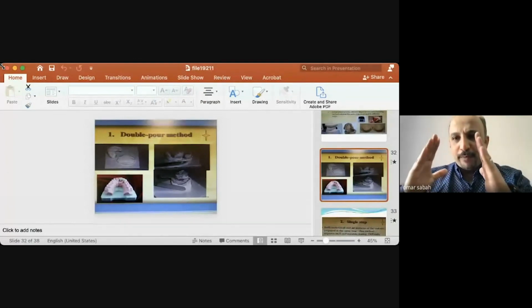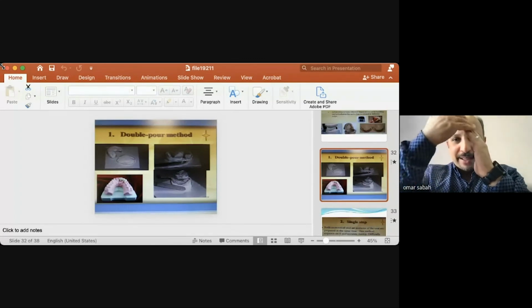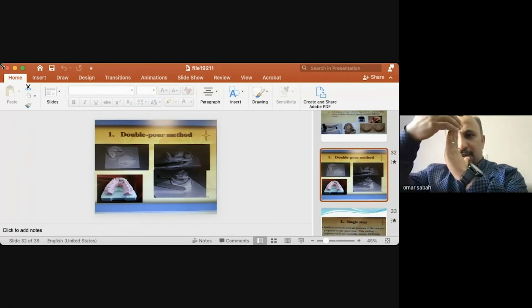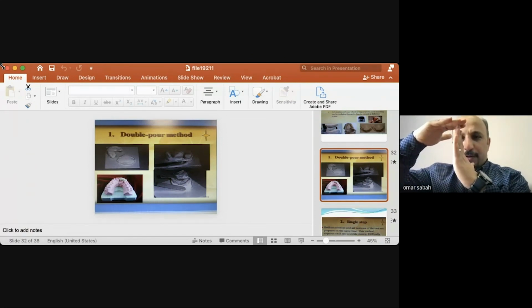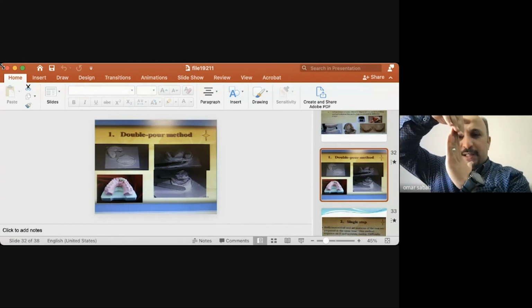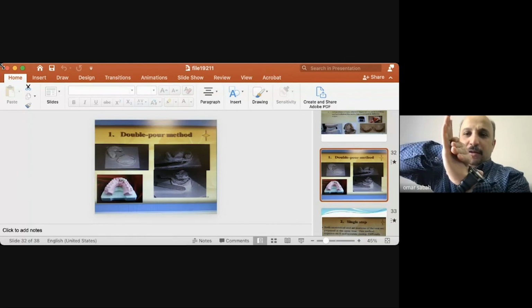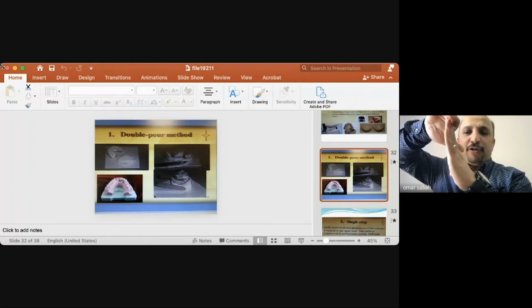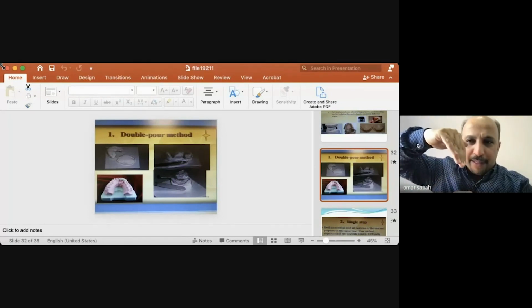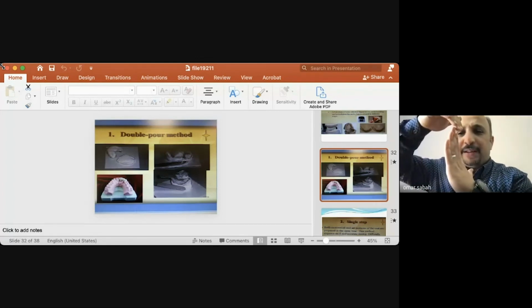الاندر كات هسه انا عندي ريدج، الريدج هاك شكله اوكي. الاندر كات وين يصير؟ هسه هذا السيرفس عندي عدل تمام. زين انا اذا عندي هاكذ ايش راح يصير عندي؟ هذا الكلوزل فيو اوكي، هذا مالت الفيستبيول. ايش راح يصير عندي؟ شوف من هوني يصير عندي مسافه، وبعدين تجيني منطقه مثل خلينا نقول ما طصه اوكي، حفره، ويرجع مرتلخ يرتفع. هتشوف شلون؟ يعني مرتفع وانخفاض وارتفاع. هاي الرج، هذا الفراغ يسمونه اندر كات هاك. زين انا هسه اشني هذا الاندر كات؟ شوف ايش يصير عندي.